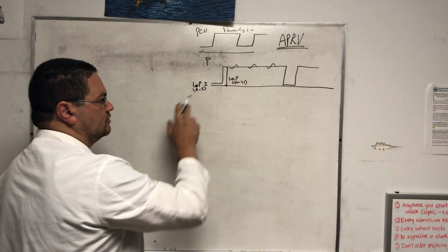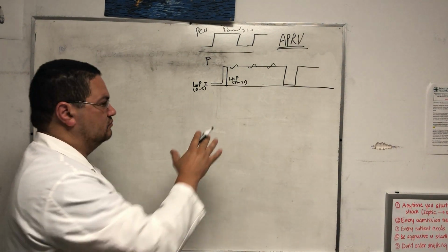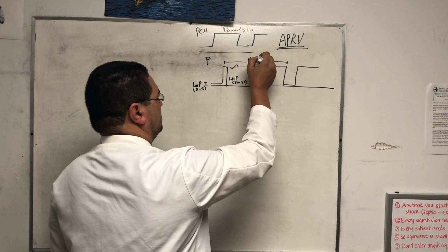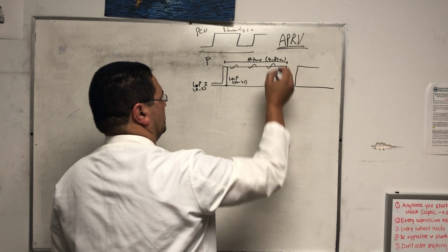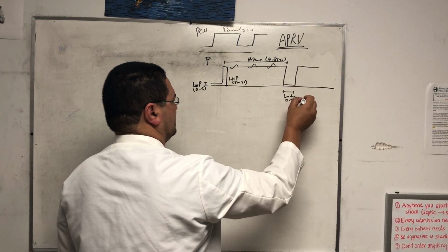When I say ranges, those are startup settings. We can titrate lower or higher than that, but to start, usually start like this. Then the high time, from here to here, ranges between 4 to 8 seconds. And from here to here is the low time, and that ranges between 0.3 to 0.7 seconds.